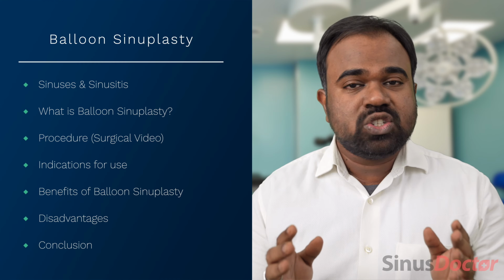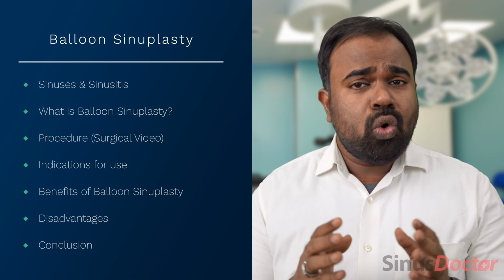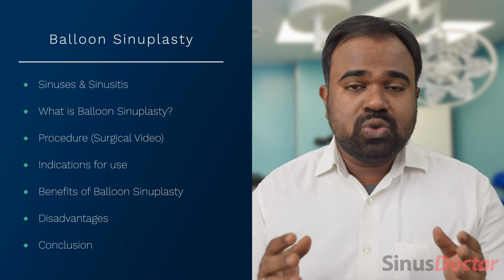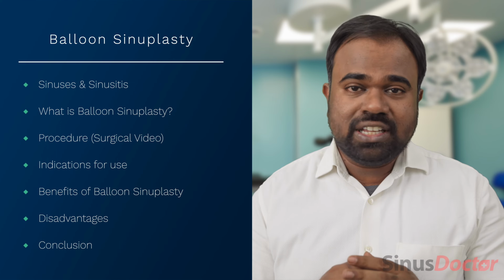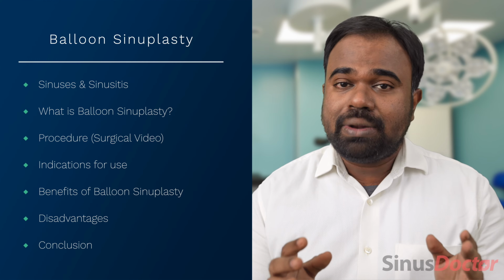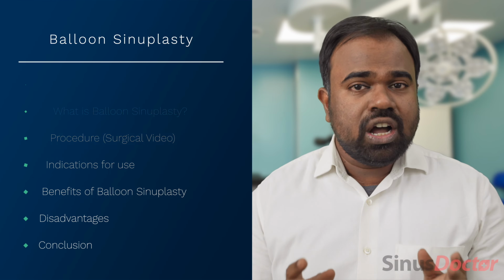Today, I'll be talking about a minimally invasive sinus surgery procedure, balloon sinuplasty. Let me give you the outline for today's talk. I'll be talking briefly about sinuses and sinusitis. What is balloon sinuplasty? I'll be showing you the procedure of balloon sinuplasty, including a short surgical video and the equipment involved. I'll be talking about in which sinus conditions balloon sinuplasty can be used, the benefits and the disadvantages of balloon sinuplasty before concluding this video.